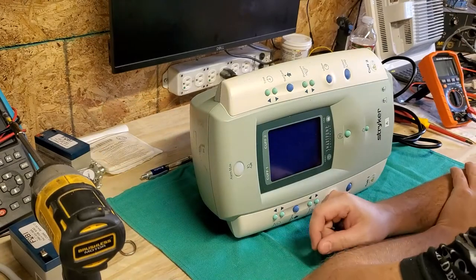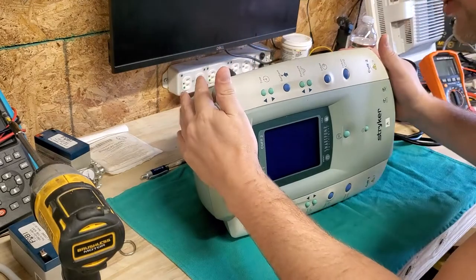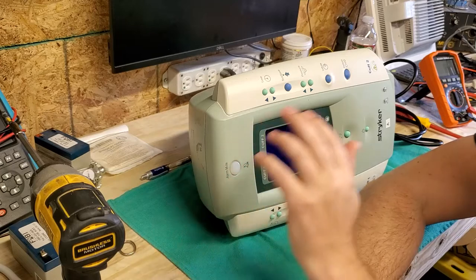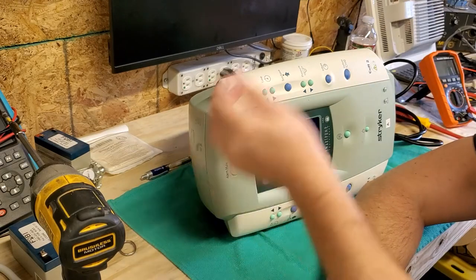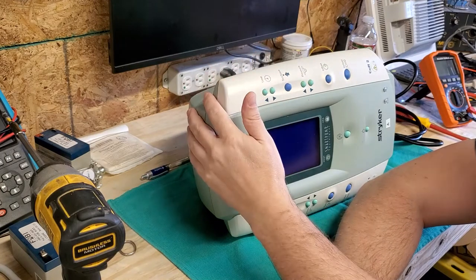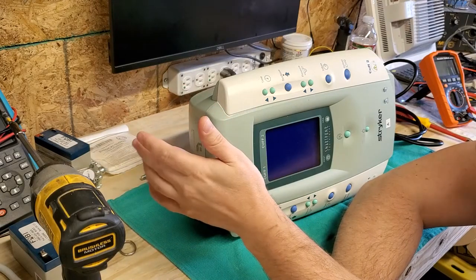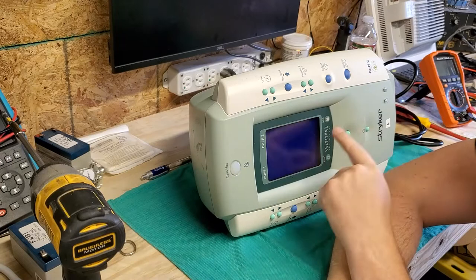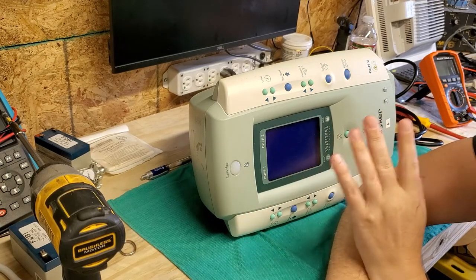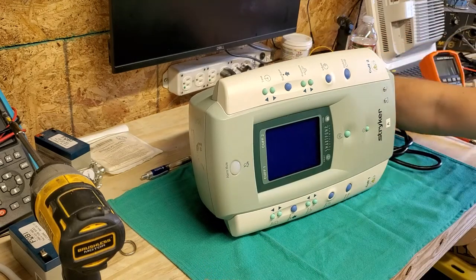Hey everyone, welcome back to Better Biomed. Today on the healing bench I have a Stryker smart pump tourniquet. This was shipped to me — I get stuff sent a couple times a week for me to check out. This one just arrived and I have no idea what's going on with it. It's a Stryker smart pump pneumatic tourniquet system. When I power it up it says code 38, and that's the only thing I know about it. Let's go ahead and power it up right now so you can see what happens.